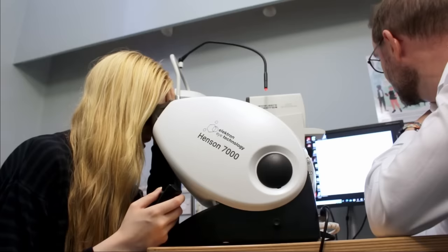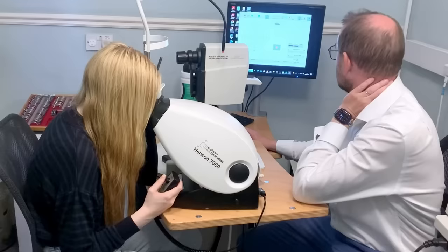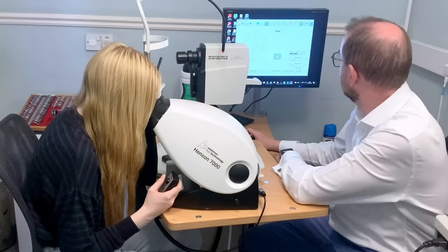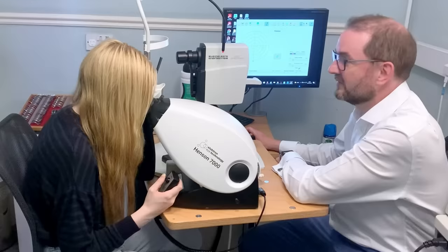Just started. Oh, I didn't press in time. No, that's okay. It's just getting the sensitivity of your eye to start with. That's good. It's quite quick. Okay, done. That's good. Didn't miss any spots. Did really well. Okay, well done. Feels like a bit of a game. I know, sort of a really basic computer game.